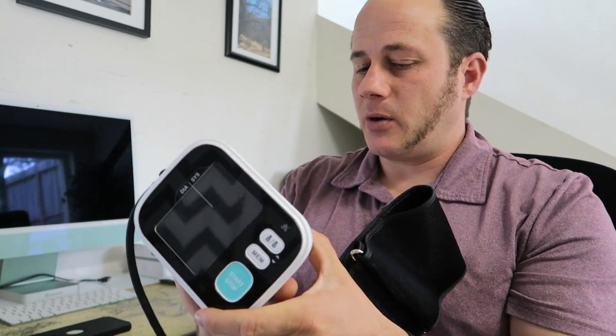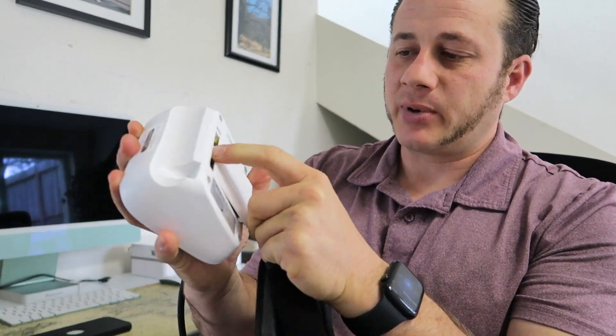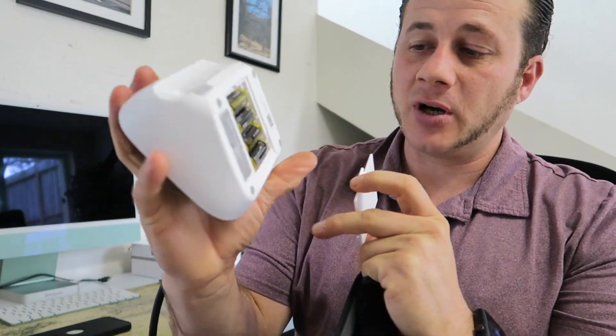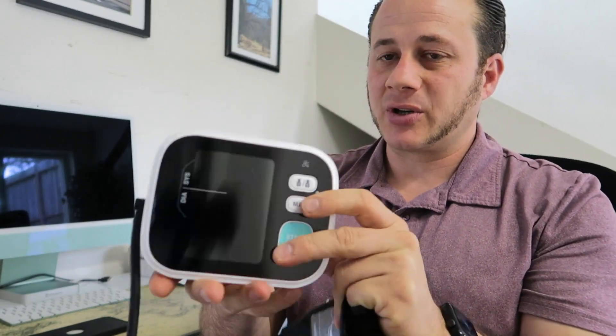It is AC wall powered — there is a port back here — but it also has a battery backup. I have it unplugged right now. It does come with four AA batteries; I just have it unplugged because it's easier to show.